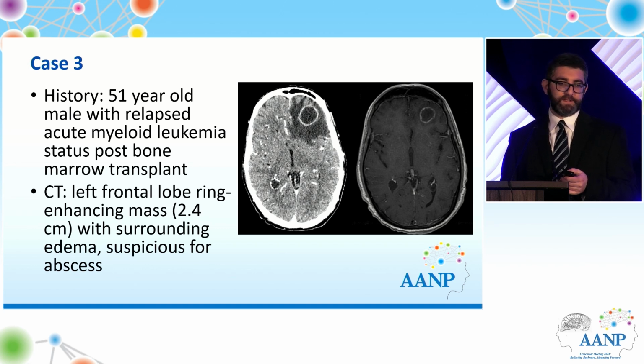The next case is a 51-year-old with relapsed AML, status post bone marrow transplant. And I've shown both the CT and the MRI because the CT, I think, is a little more dramatic. And it shows up to 2.4 centimeters of ring-enhancing lesions. And the radiologist got this one right.